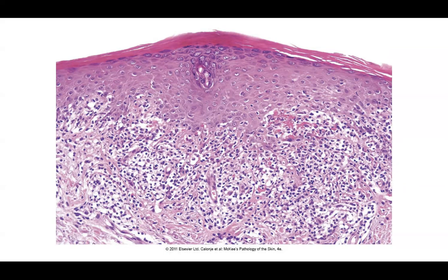If it said rule out melanoma or rule out regressing melanoma, then doing stains to make sure that you don't have some hidden SOX positive contiguous growths or PRAME positive contiguous growths is important. I've found some sneaky regressing melanomas that way. And so I highly recommend, if there's any suspicion at all, just to do the stains and make sure. Most of the time, the BLKs are just BLKs. If they look like a BLK, it is a BLK.